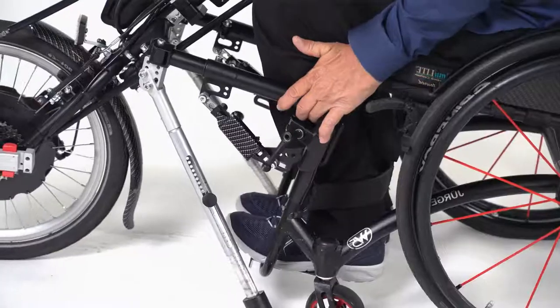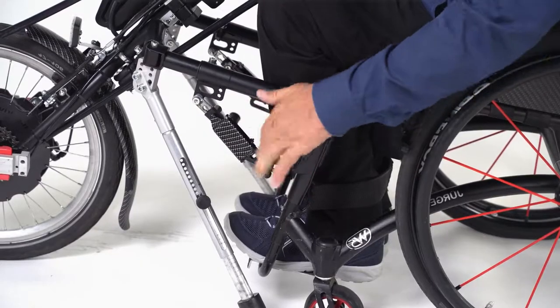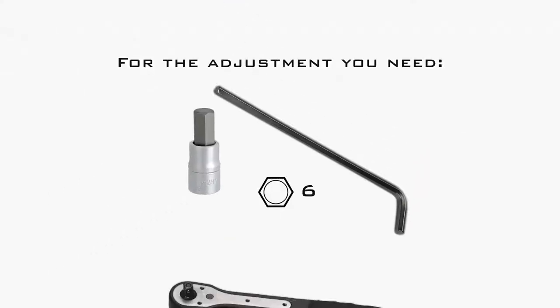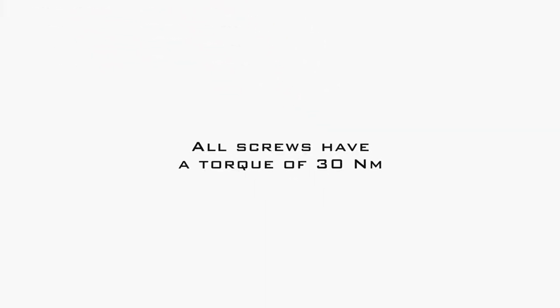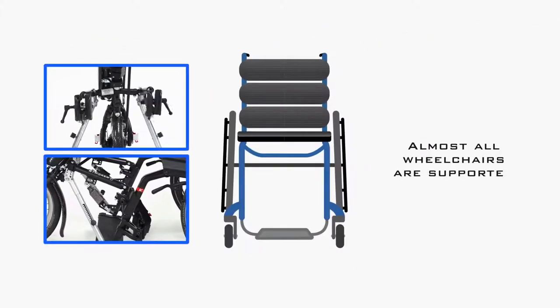Our adaptive bikes have to be fitted to the wheelchair once. After that they can be coupled and uncoupled very easily and quickly. For the adjustments to your wheelchair you need the supplied 6 millimeter allen key or a 6 millimeter allen socket spanner with ratchet. All screws used in the video have a torque setting of 30 newton meters.